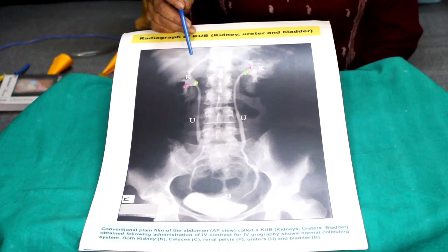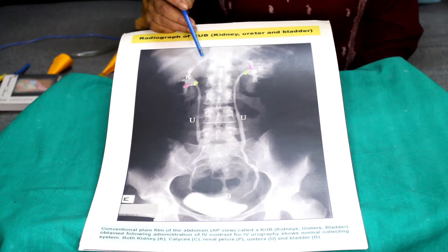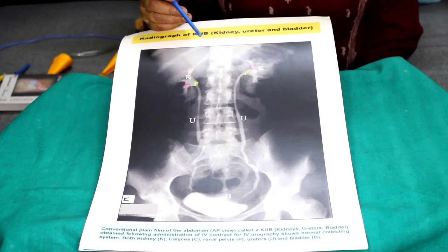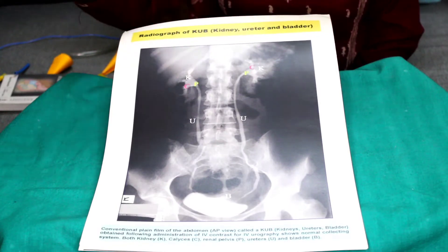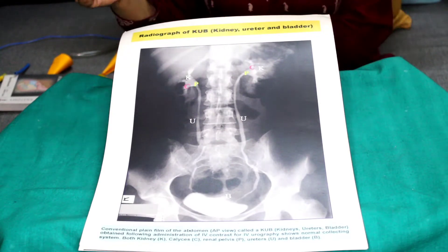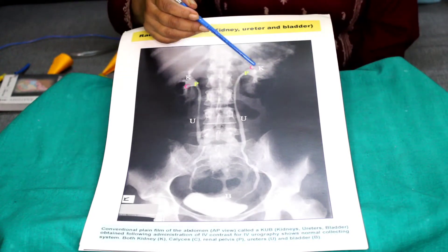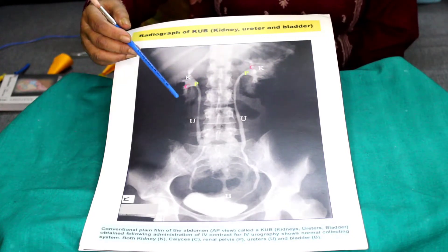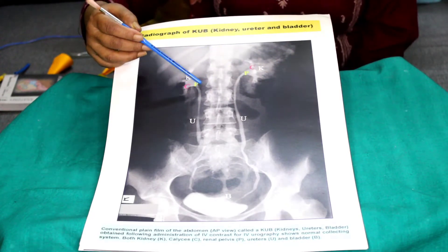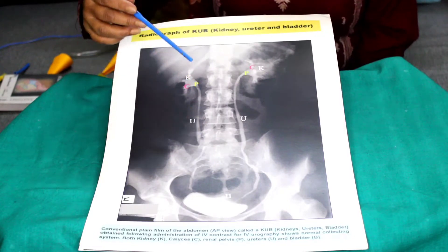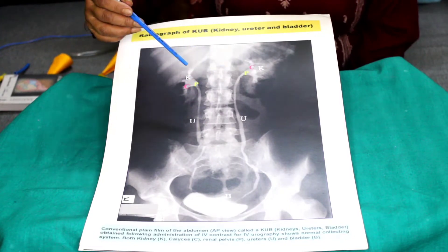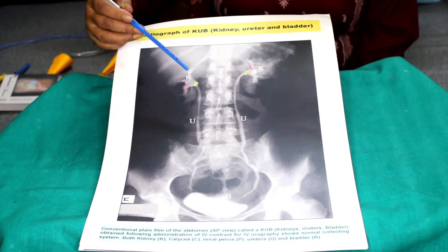Hi everyone. This is the intravenous pyelogram of the kidney, ureter, and the bladder. You see why this intravenous pyelogram is done — because the kidney, ureter, and bladder are soft tissue shadows. They cannot be visualized on a straight X-ray.